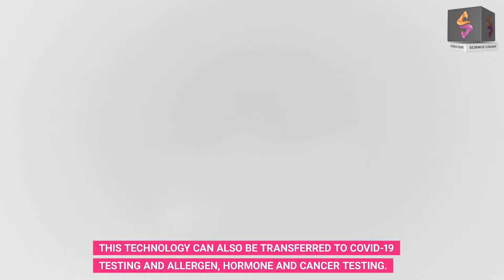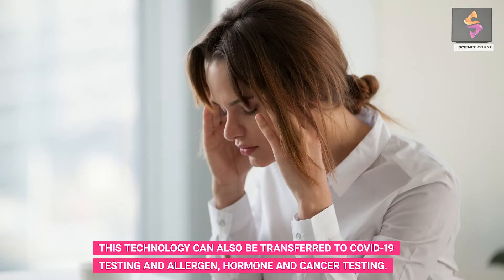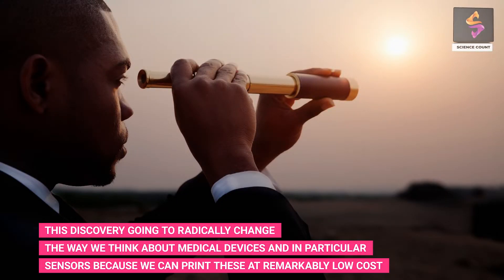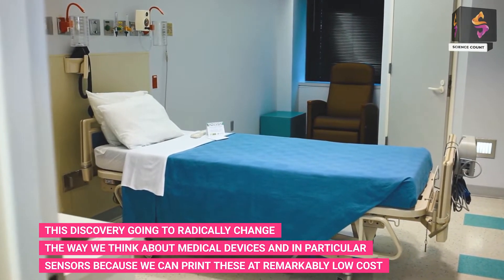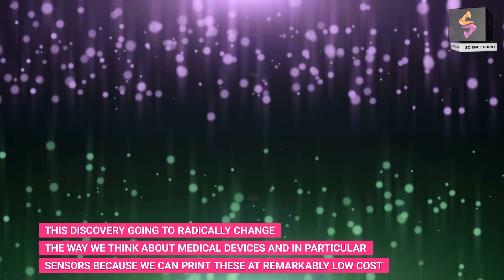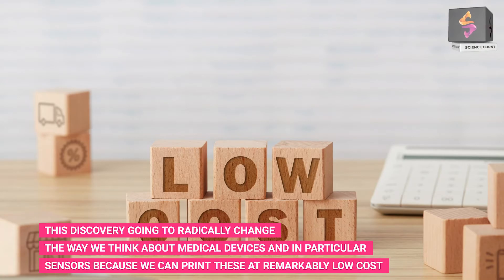After passing clinical trials, this technology can also be transferred to COVID-19 testing and allergen, hormone, and cancer testing. This discovery is going to radically change the way we think about medical devices and sensors, because these can be printed at remarkably low cost.